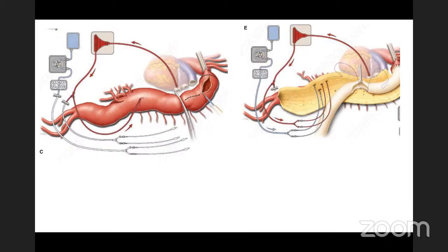Most of the people just use femoral and don't bother to do anything with the distal descending thoracic aorta or abdominal aorta. But if you have a big aneurysm, like within 5 or 10 centimeters of the descending thoracic aorta, and you need to clamp above it and below it, that's not a problem. You can just place your cannula just distal, no issues.